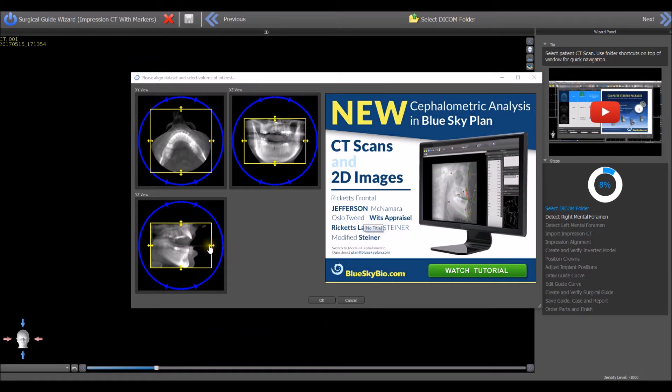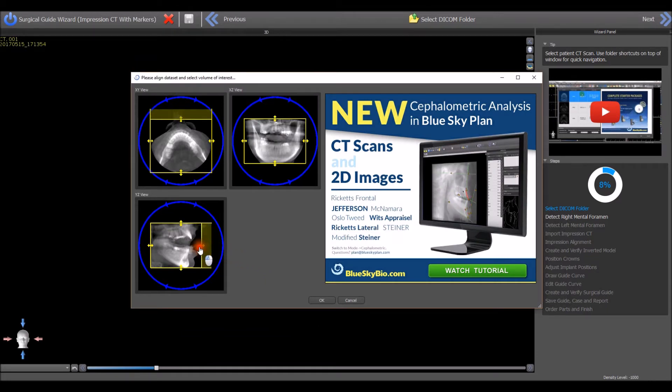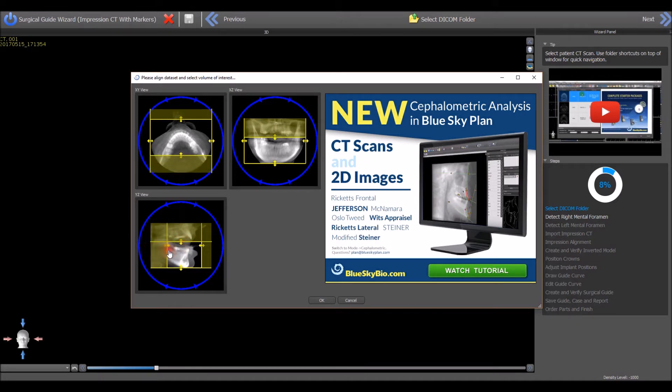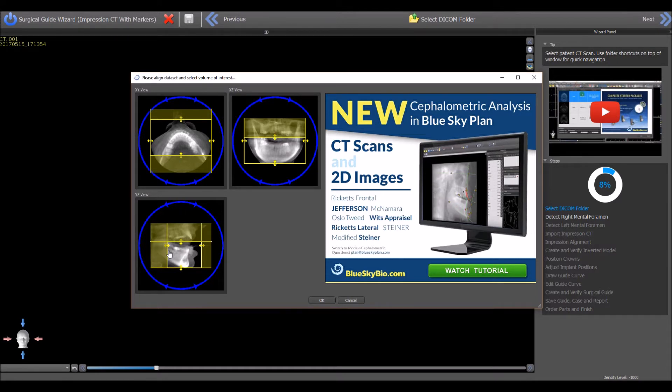Press the OK button. Use the left mouse button to grab and drag the yellow border lines to reduce the field of view and define the area of interest. Reducing the field of view better utilizes your computer's resources and enlarges the relevant anatomy in the software view. Press the OK button.